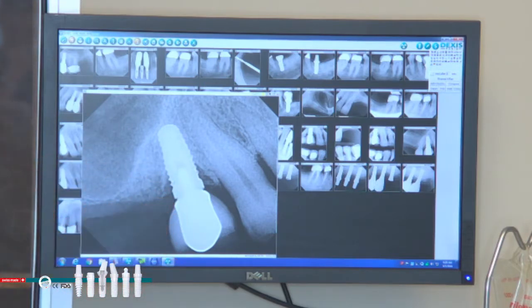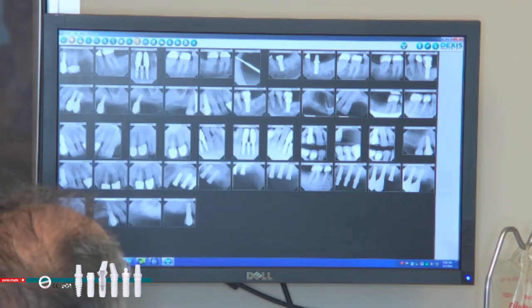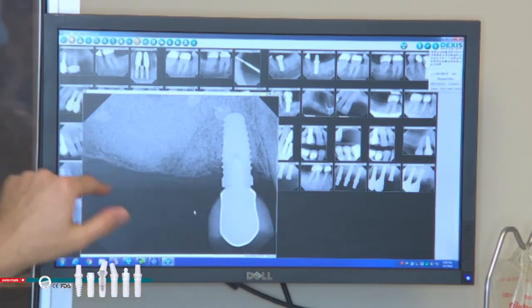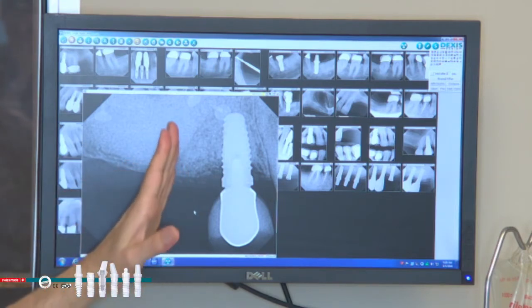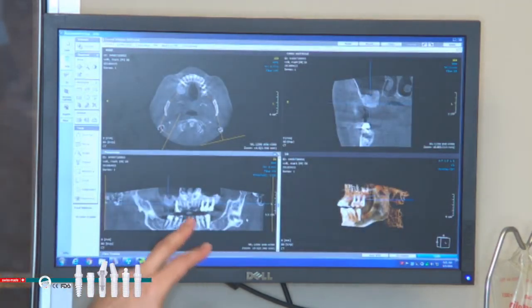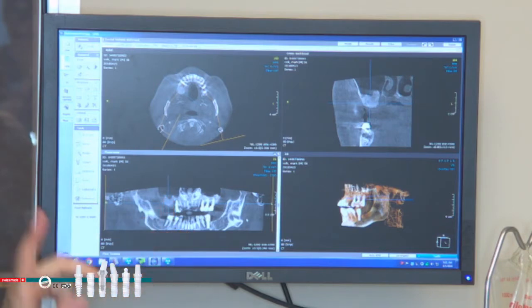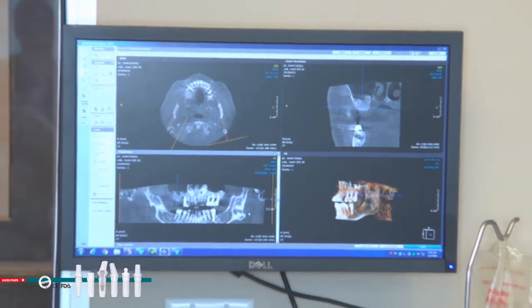pocket resolved in that area. Now, what we have is this X-ray that doesn't show the angular bone loss any longer, and it shows bone graft in the sinus. And we're going to place one implant in area number 4 here, a zirconia Z Systems implant. And I'm going to show you the CAT scan here that shows the sinus grafted on the upper right side, and the implant that's going to go in there. In the future, he's going to get tooth number 3 and 31 replaced, upper and lower.